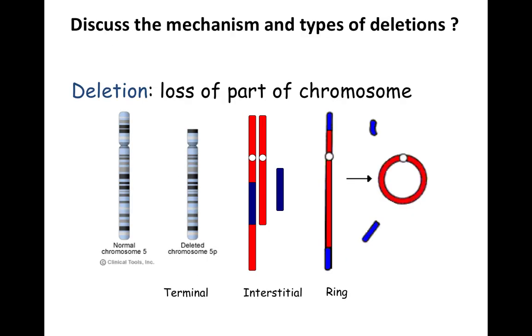This is the second type of chromosomal abnormality which is called the deletion. الديليشن معناها أني بفقد جزء من الكروموسوم loss of part of chromosome نتيجة لبريك حصلت في الكروموسوم كسر في الكروموسوم وجزء من الكروموسوم اتفصل وما لزقش did not join back and was lost.